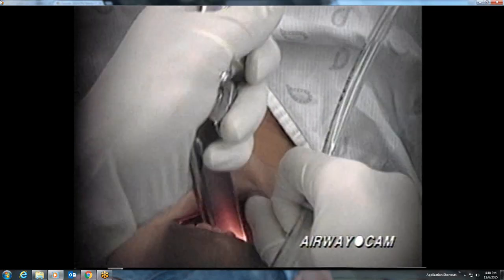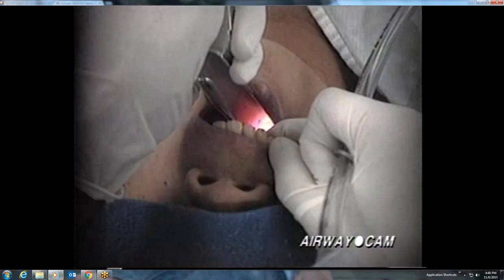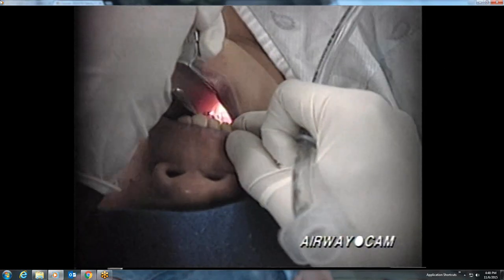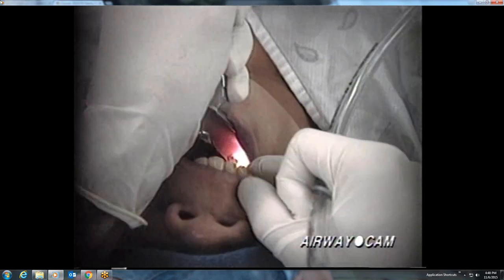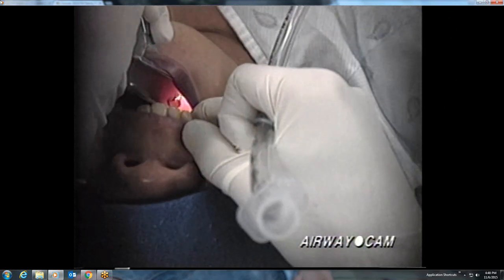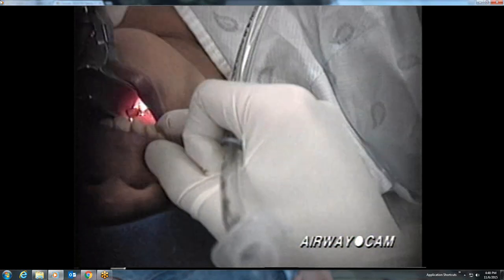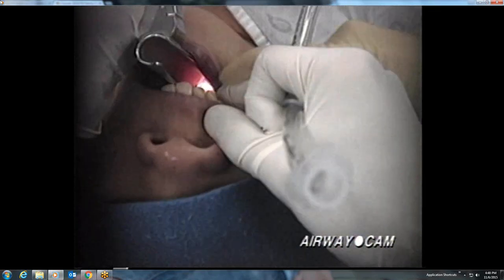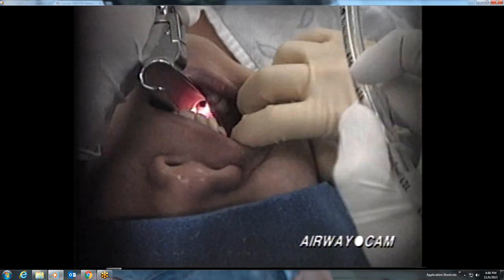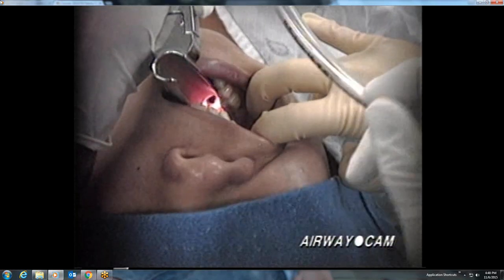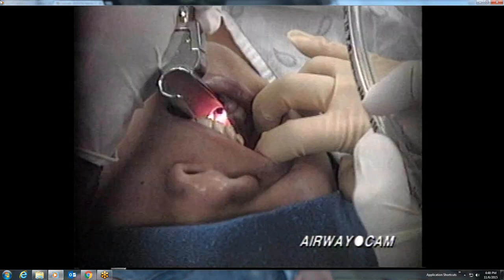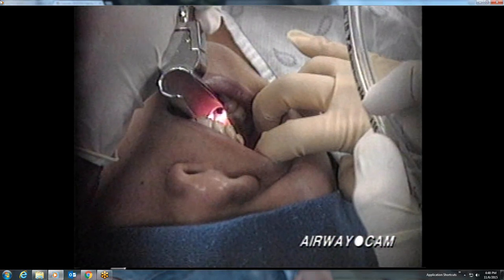The next laryngoscopy is performed with a Wisconsin blade, a straight blade with a larger and more round flange than the Miller blade. The epiglottis is elevated directly by the tip of the blade. Finding the correct depth of blade insertion and lifting the epiglottis requires a slight in-and-out motion. The laryngoscope is then lifted at a 45-degree angle in the direction of the handle. Lip retraction provides improved visualization down the right side of the mouth. Note the round, almost tubular appearance of the flange of the Wisconsin blade.